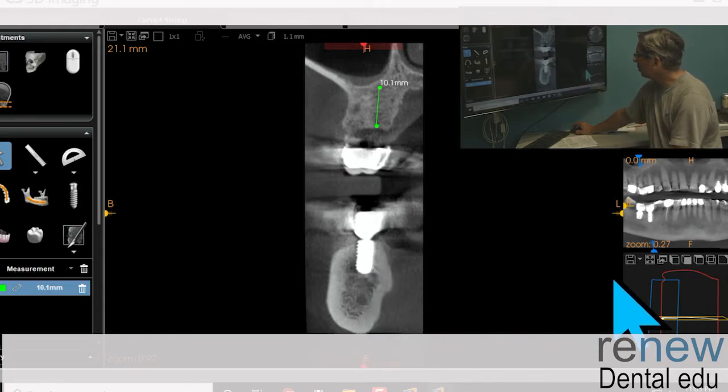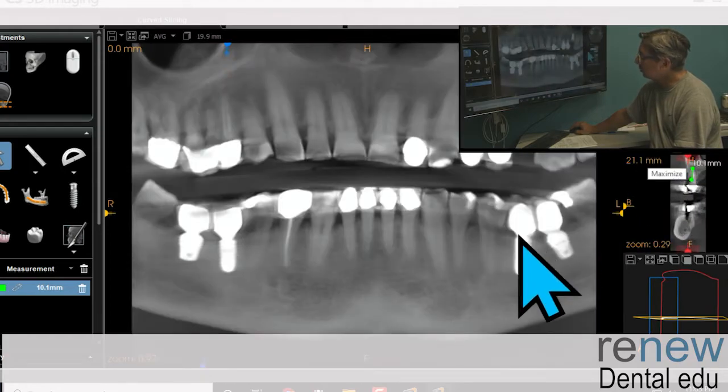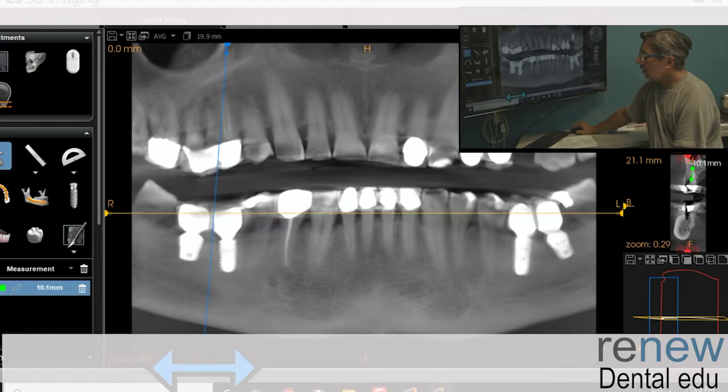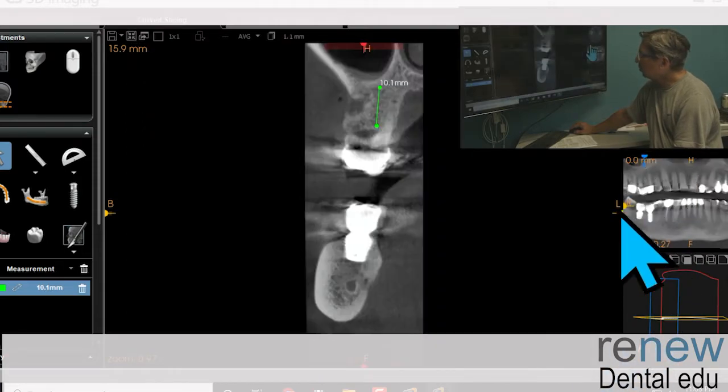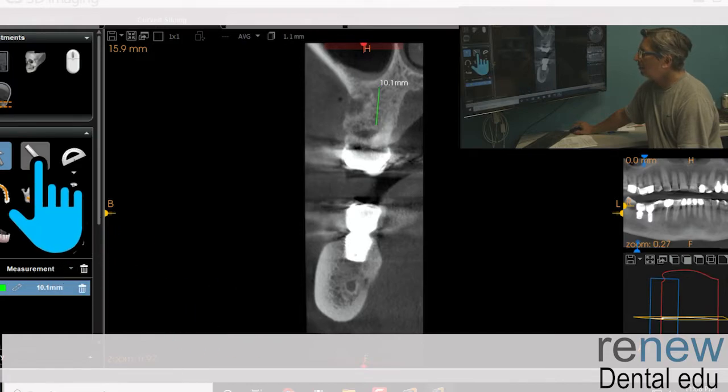This implant could have been a little longer on the bottom. So let's also look at that here. So let's look at these two here. Now that could have been a little bit longer. We have room there, and that means that this could have definitely been longer for sure. So both of these look like the person placing them possibly was a little gun shy, or probably didn't have a lot of expertise and was a little gun shy. I could see that for sure.